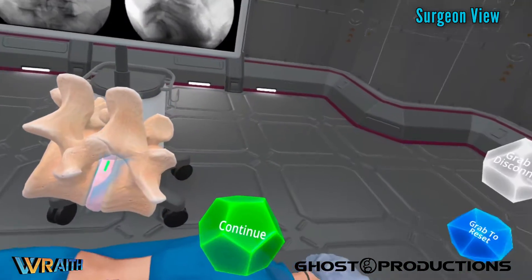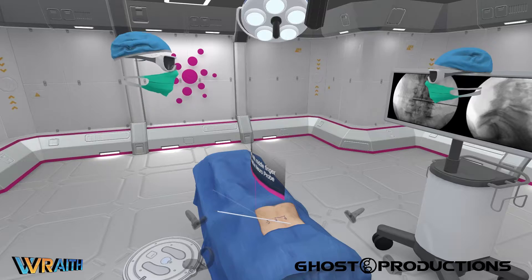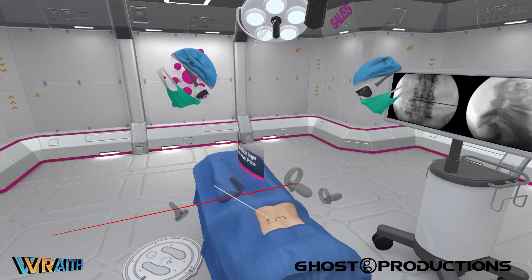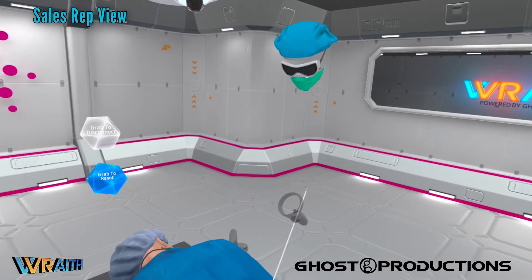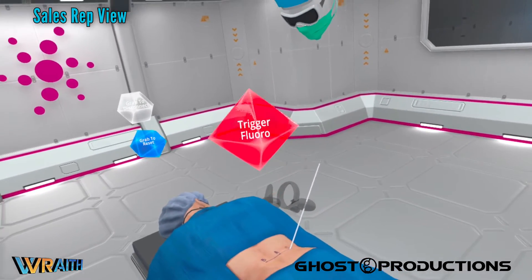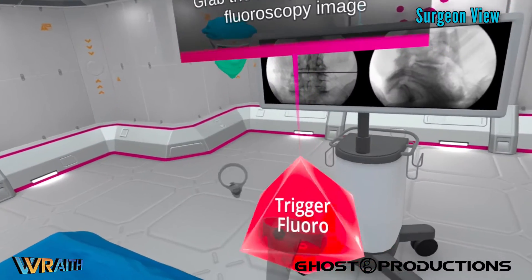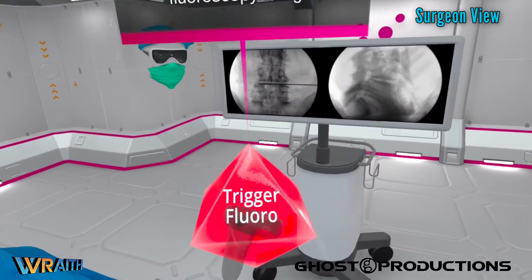I could watch that again or just continue on. So we have a neural probe that has an energized tip to detect nervous anatomy — specifically the nerve root — on our way in toward the disc space. You want to advance that until you feel the margin of the annulus and it'll stop. Now we'll confirm that position with fluoro.